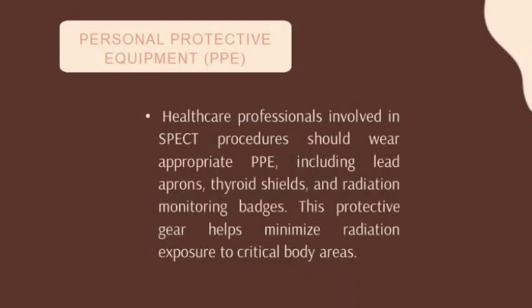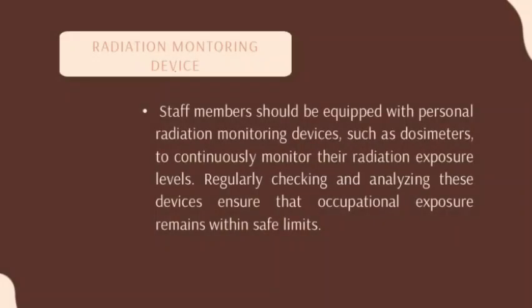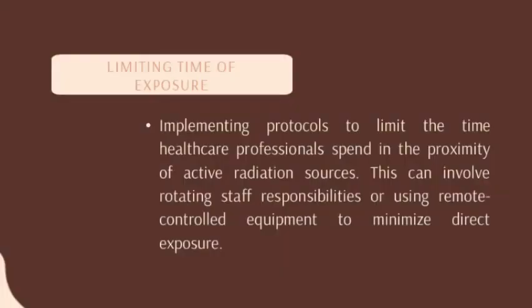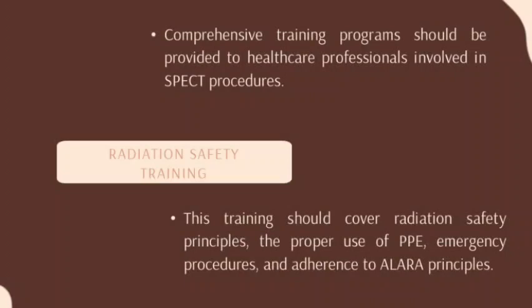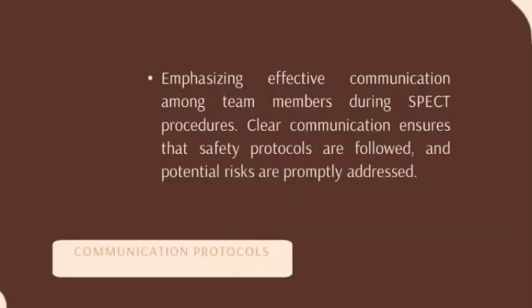Personal safety measures involve the proper use of PPE, continuous monitoring of radiation exposure, and implementing protocols to limit the time of exposure. Additionally, comprehensive training programs ensure that healthcare professionals are well versed in radiation safety principles, equipment operation, and effective communication during SPECT procedures.